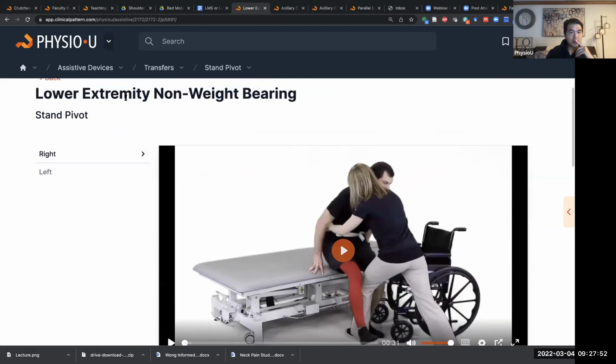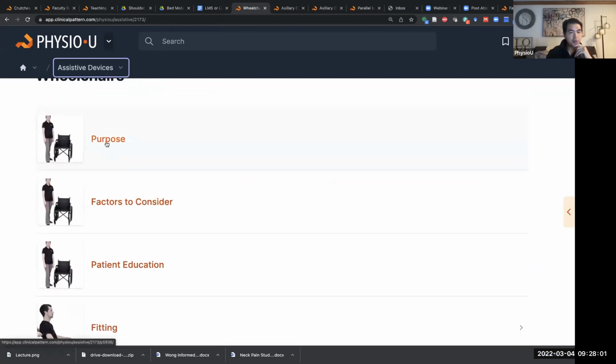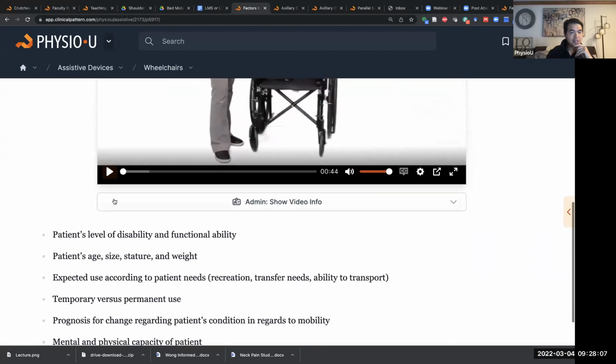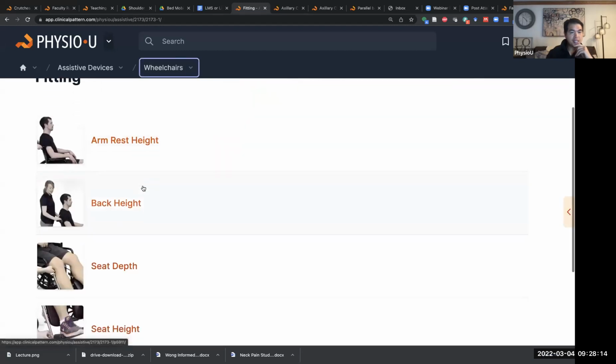Okay. All these different transfers are available. Students have watched this all on their own. Let me move into wheelchairs. For wheelchairs, what we've done is we've created short videos about what they're for, factors to consider, and also all the basic fitting concepts.